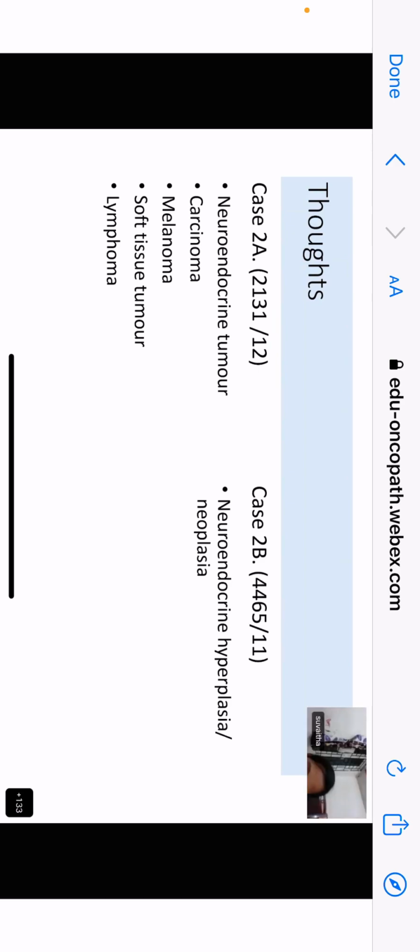Dia, ma'am, I think 2A is a carcinoma, ma'am. You think it is a carcinoma. All right. Would you like to explain why a carcinoma is arising in the submucosa? Ma'am, it's a little odd. Okay, very good. So now tell me which of these tumors, 1, 2, 3, 4, 5, would begin in the submucosa or would be mainly present in the submucosa?